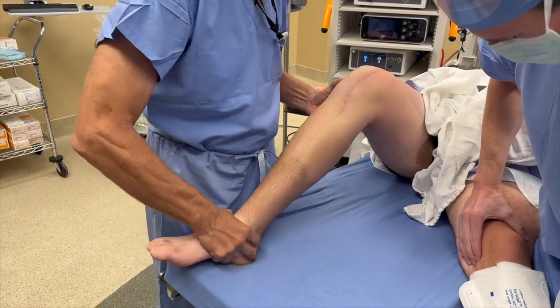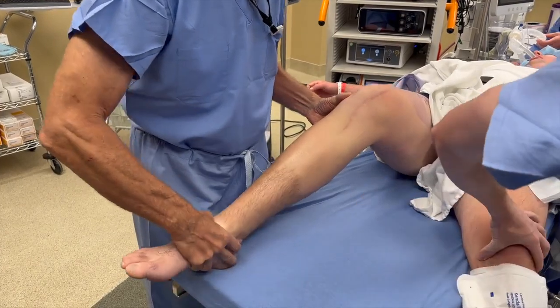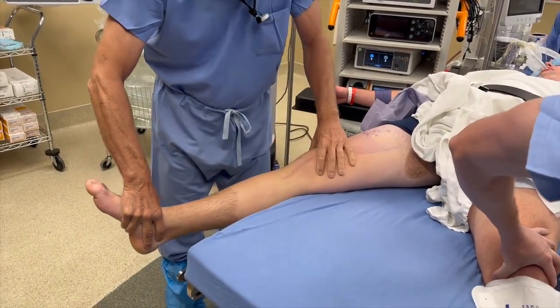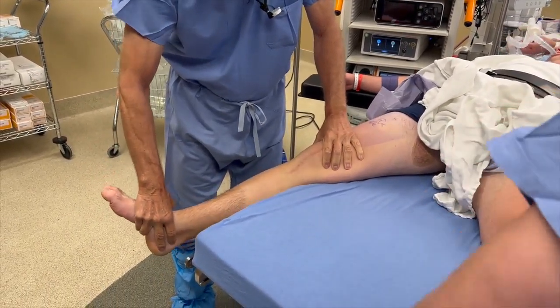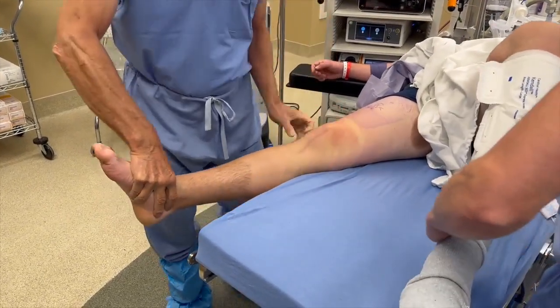The patient is positioned in the supine position on the operating table and induced under general anesthesia. A knee exam including valgus stress testing in extension and 30 degrees of flexion, and anteromedial rotation via the anteromedial drawer test at 90 degrees, is performed to validate the clinical exam findings.